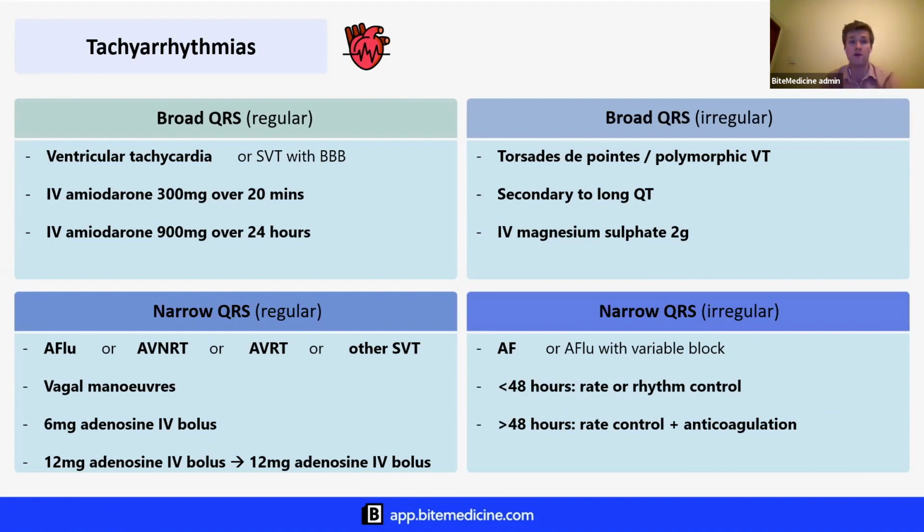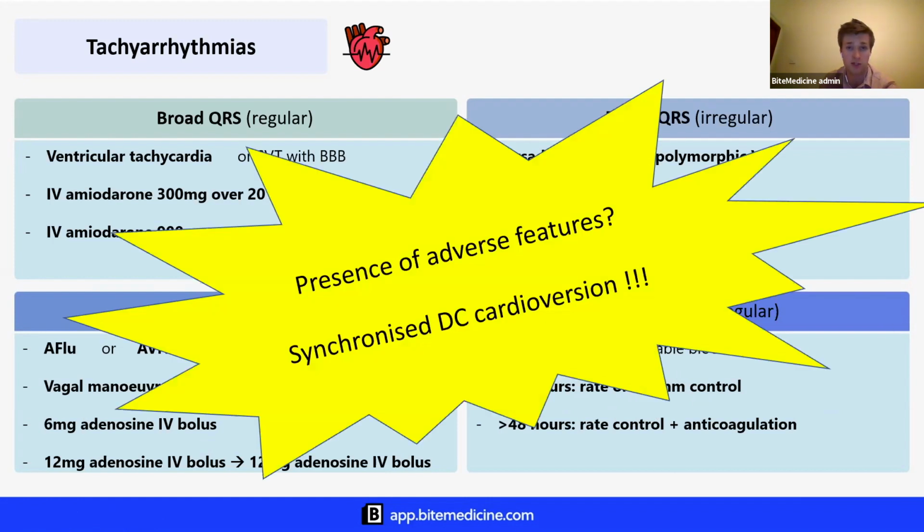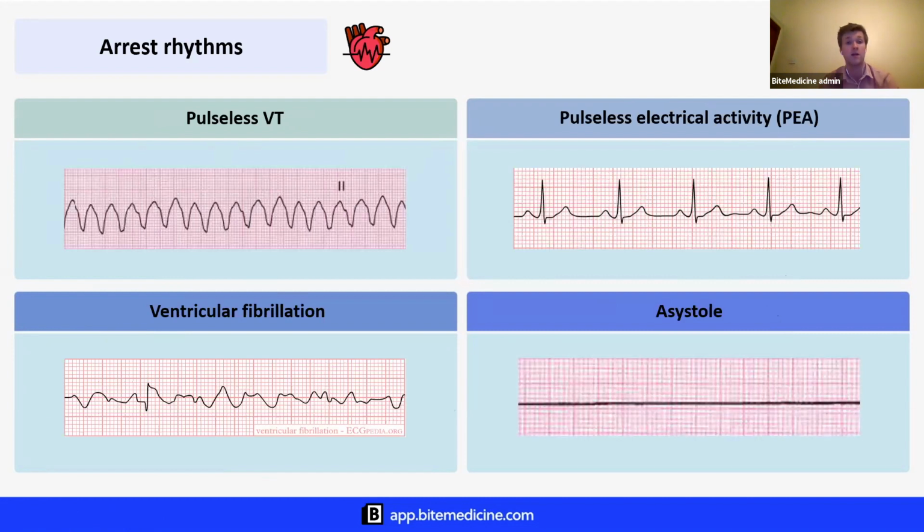Before we briefly touch upon bradyarrhythmias, which will take no longer than 5 minutes, I also just wanted to touch upon some arrest rhythms with you guys. On the left here, we've got a broad complex tachycardia. Without a pulse, that would make this pulseless VT. And beneath it here, we've got completely disorganized electrical activity without a pulse, which is classically VF. Now, these are our shockable rhythms.